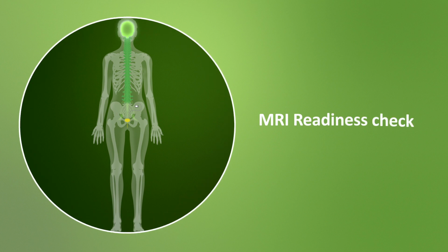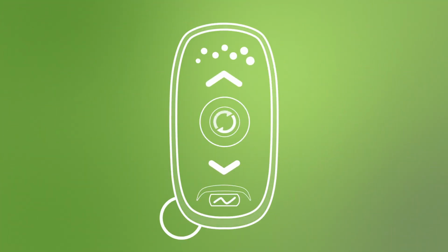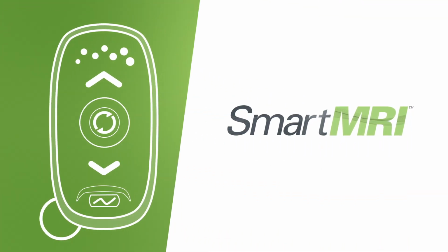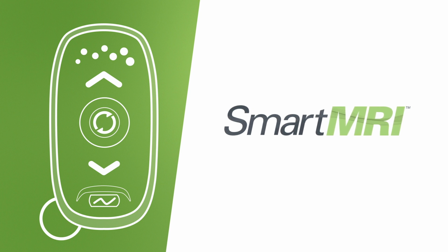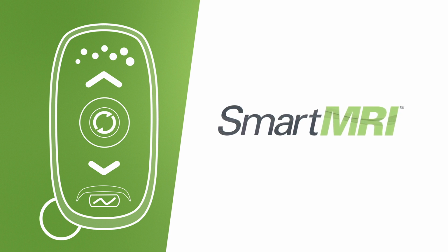Next, we'll share some information about what to expect when you get an MRI with the Axonics system. When you arrive for your MRI, be sure to remind the MRI center that you have an Axonics implant and provide them the MRI readiness sheet. They can also talk directly with the Axonics team if they have any questions. Some MRI scans, particularly whole body scans, require an MRI readiness check to confirm MRI eligibility. The Axonics remote control with smart MRI technology lets you complete this check just before your MRI, without having to go to your doctor's office first. You and your MRI technologist can do this check together.